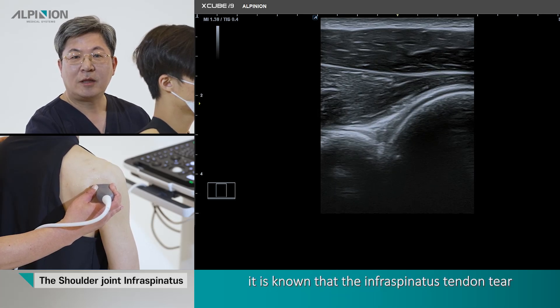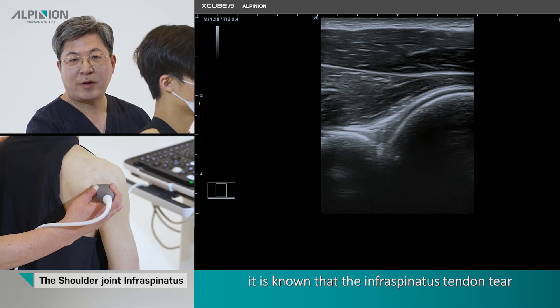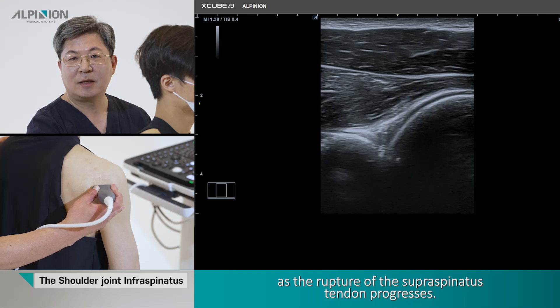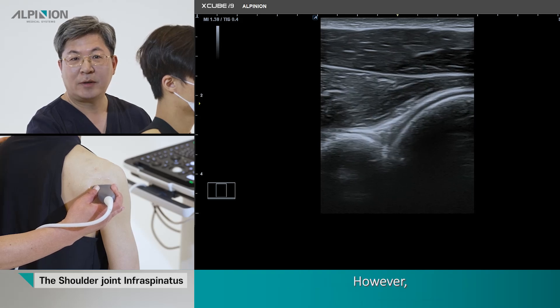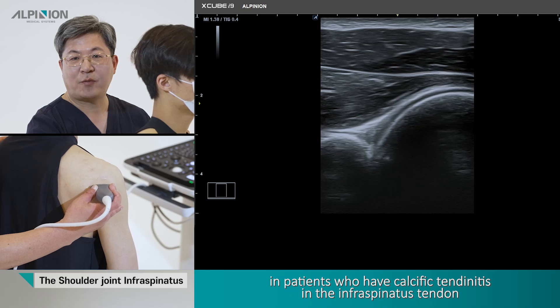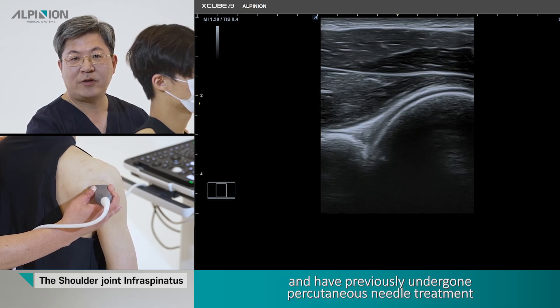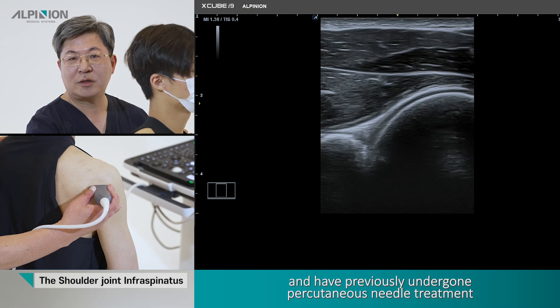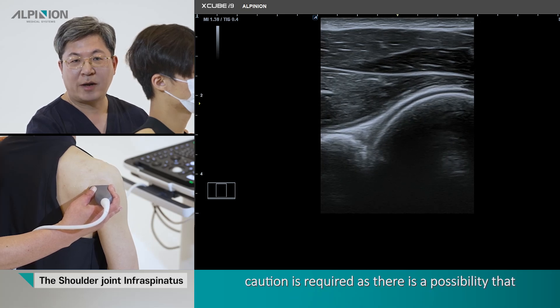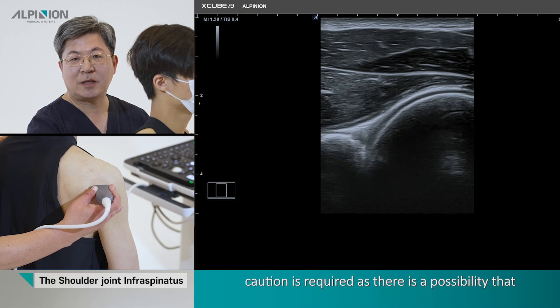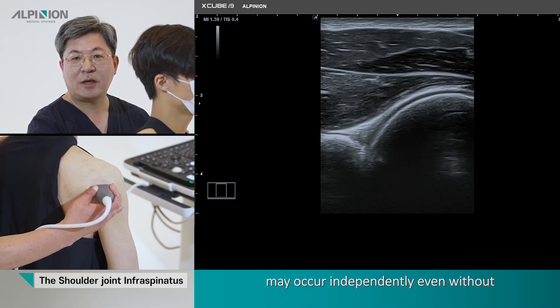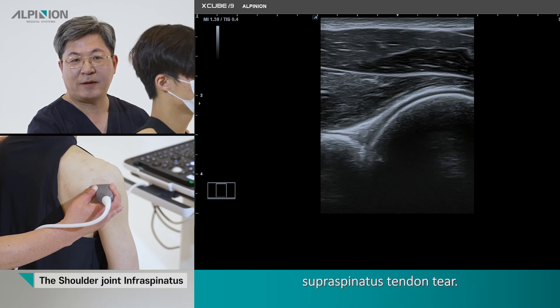In general, it is known that the infraspinatus tendon tears as the supraspinatus tendon rupture progresses. However, in patients who have calcific tendinitis of the infraspinatus tendon and have previously undergone needle treatment, caution is required, as there is a possibility that the infraspinatus tendon tear may occur independently, even without a supraspinatus tendon tear.